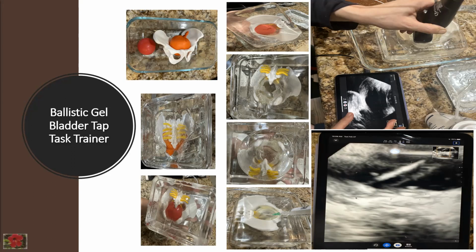And I think, Mona, you bought the same spine model, right? Correct, yes. I'm sending the Amazon link to Karina so that maybe she can add it to the chat. The spine models that I bought were about $30, and you had both the spine and the pelvis. So we used the pelvis for the bladder phantoms and then the spine for the lumbar puncture. So it was kind of like a 2-for-1 deal. Yep.